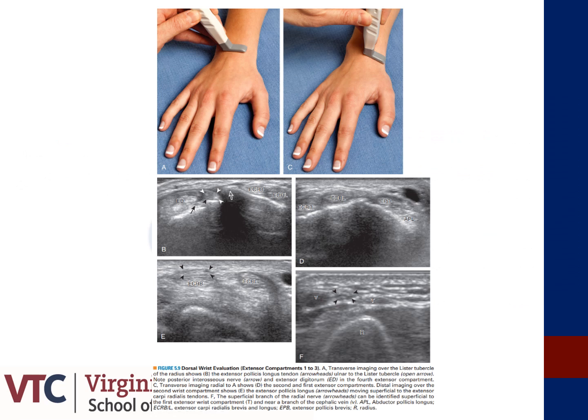Figure B demonstrates your second extensor compartment in relationship to Lister's tubercle, and your third extensor compartment consisting of EPL as it traverses past Lister's tubercle, followed by your fourth extensor compartment containing your extensor indicis and your extensor digitorum. Figure D represents the relationship between your first and second extensor compartments.